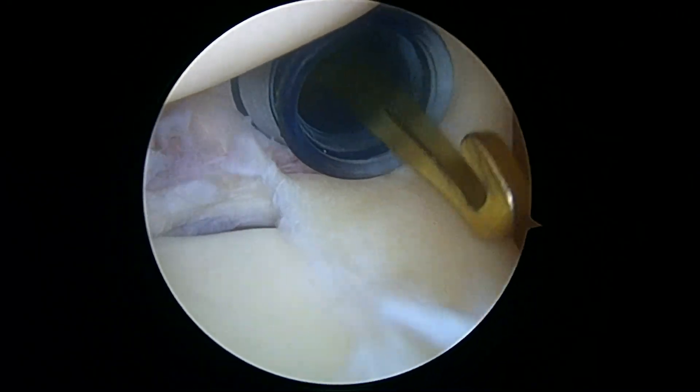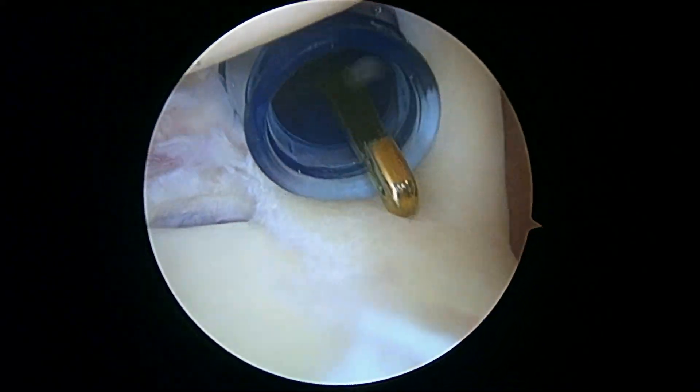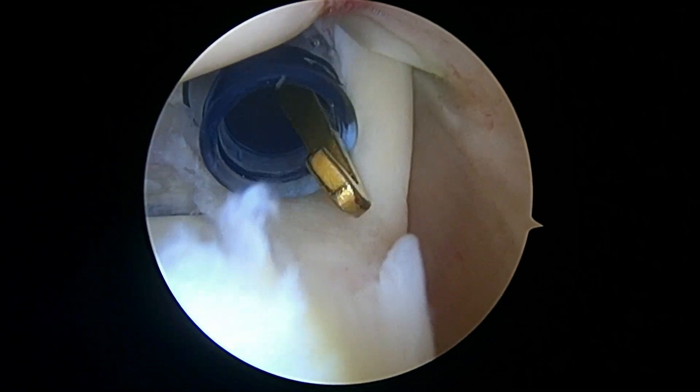So that's what bothers you and that's what hurts. We're going to do a biceps tenodesis for you. That is what a slap lesion — a type 2 slap lesion in particular — looks like.